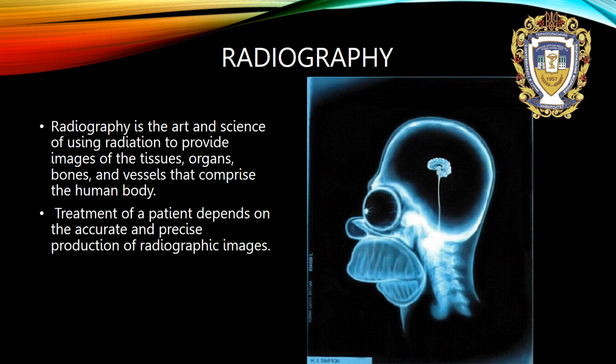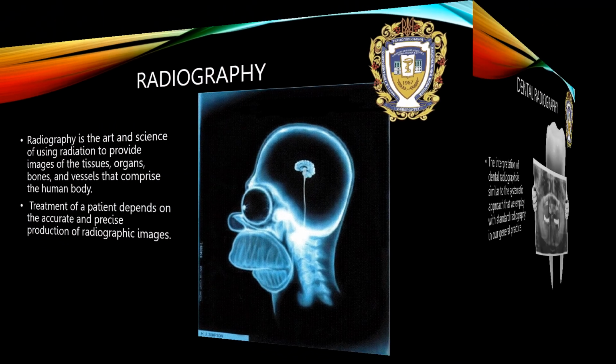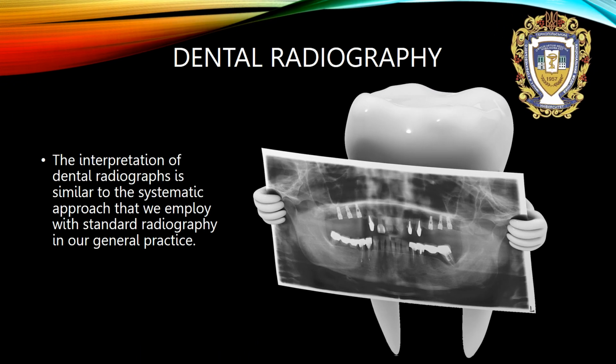Treatment of a patient depends on the accurate and precise production of radiographic images. The interpretation of dental radiographs is similar to the systematic approach that we employ with standard radiography in our general practice.